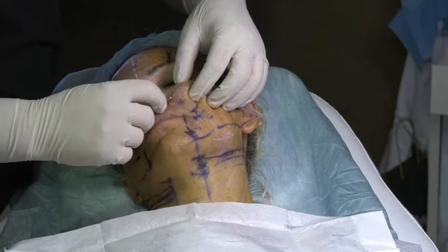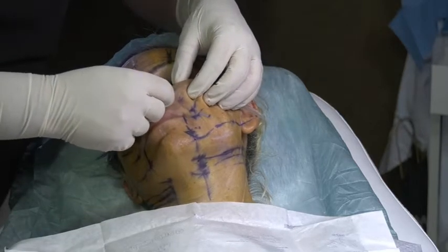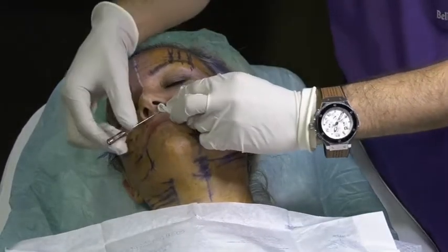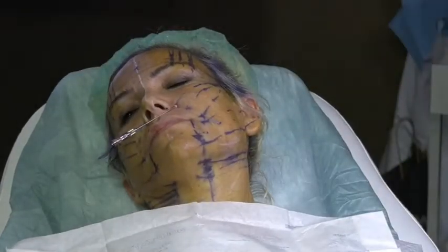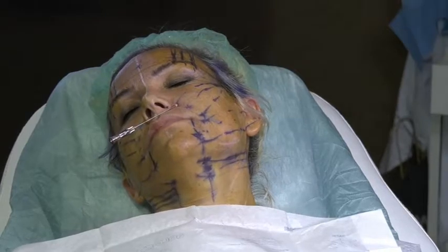You understand? It's clear what I'm saying? If I drive like that, I go superficial. I have to drive like that. So I go. And then I check again. Each time I drive, my eye should see, my hand should feel. Not just ta-ta-ta-ta-ta at the end, where I am good or bad, I don't know. No. Each step, carefully, slowly, each time I check, easy.